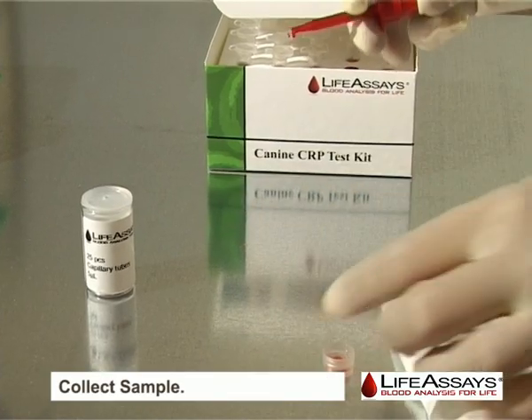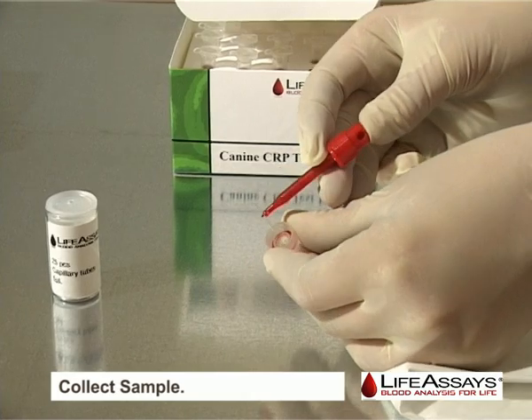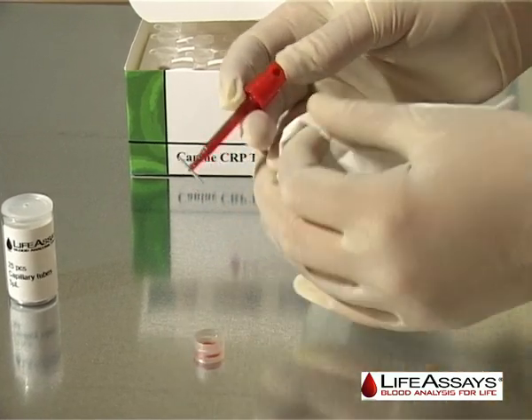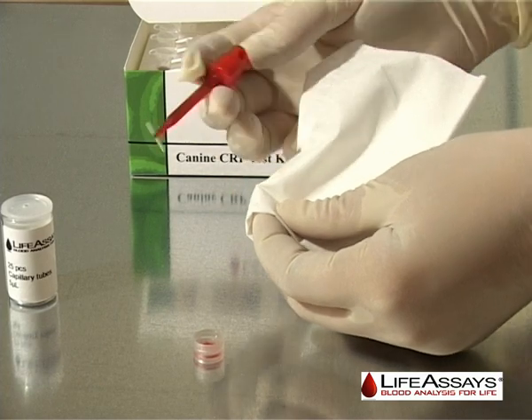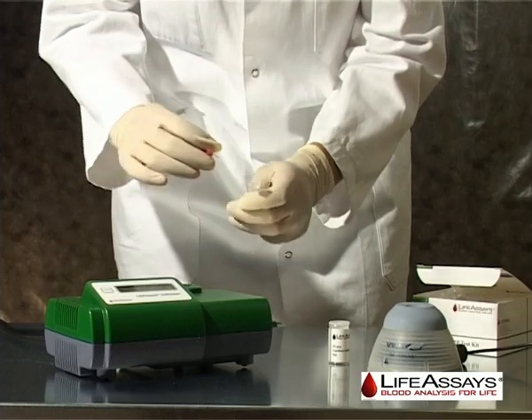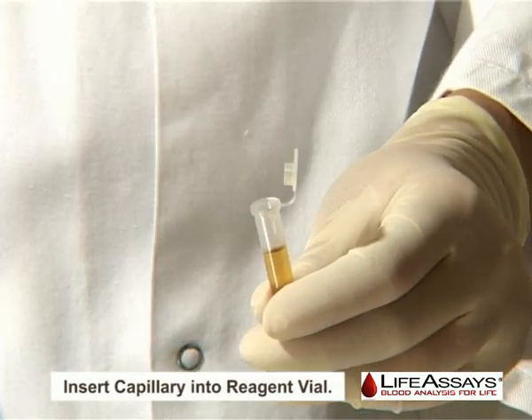Collect your sample using a glass capillary provided in the reagent kit and a capillary holder. Unload the reagent vial from the instrument, open the reagent cap, and drop the glass capillary into the reagent vial.